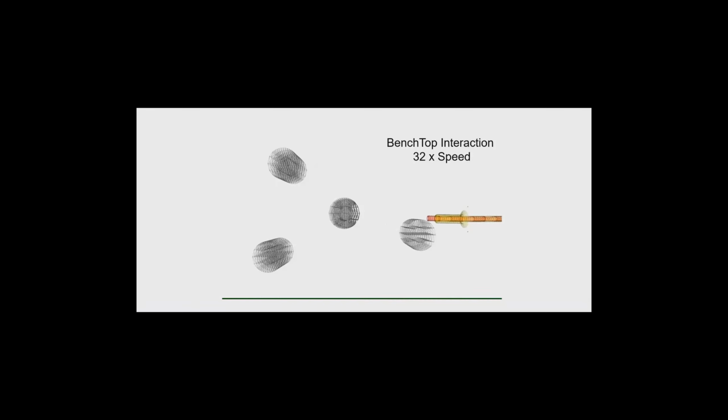We showcased cases with complex interactions of the robot with the scene. And in this video, you see the steerable catheter in red and the growing sheath in yellow. This is actually the first realistic, or let's say high fidelity, model of a sheath during eversion growing. All the other models in the literature simply have simplifying assumptions for capturing this change of length in the system.